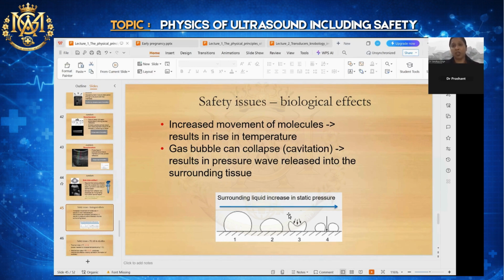But for example, if you're doing a level 2 TIFA scan for a patient where the baby is not showing and you're doing it for so long, you can do a better thing, no? You did it for 5 minutes, stop the case, tell the patient, please walk around, baby. I do TIFA. In the morning, I've done 5 TIFA before coming for the class. And 2 I have not completed. I have told them to wait.